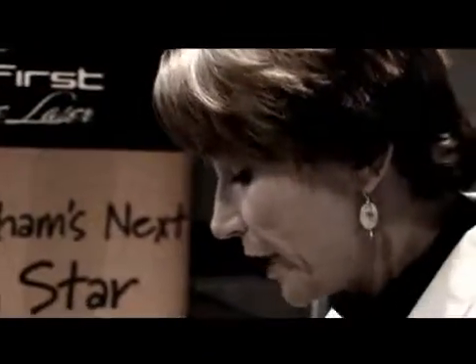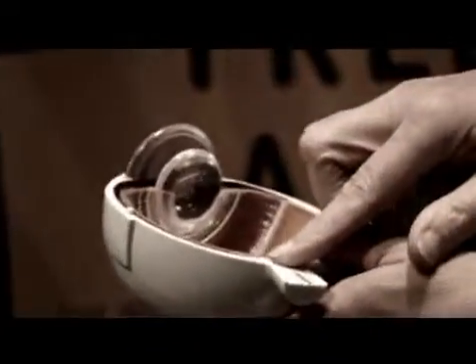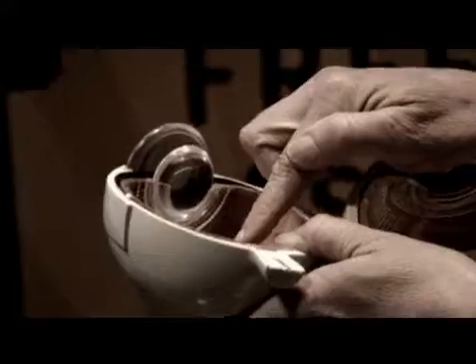Come on back. My name is Tammy. I tell you what, have a seat right here. Forehead all the way up against that band there. Looked at your degree of nearsightedness, and you're really stretching what's considered the limit of what the laser is, and I kind of hedged you on that when you came in. That's a really large amount of nearsightedness. The curvature of your cornea determines a lot of how nearsighted you are. The light hits the curvature of the cornea, is passed through the lens and is focused on the retina. In your situation, you have a kind of steep cornea, but you have a long eyeball, and that's what determined that you're really nearsighted, okay?